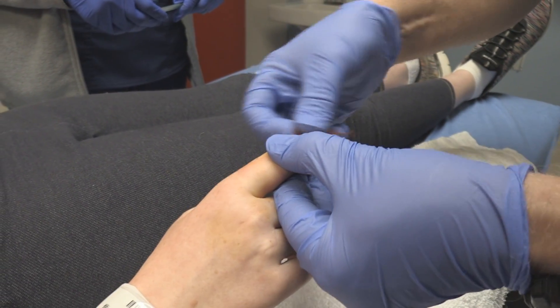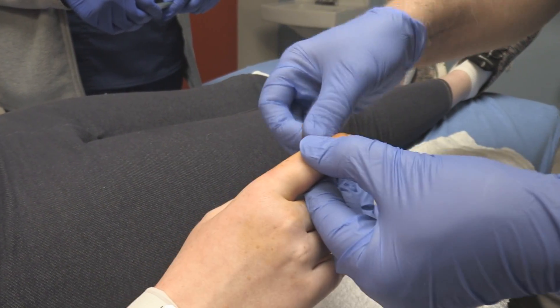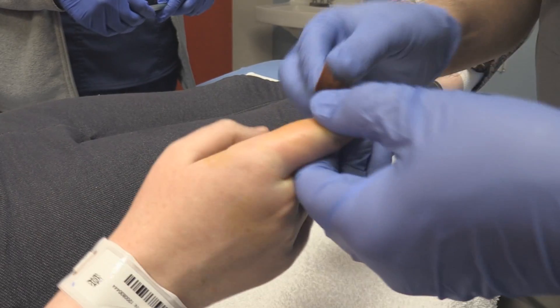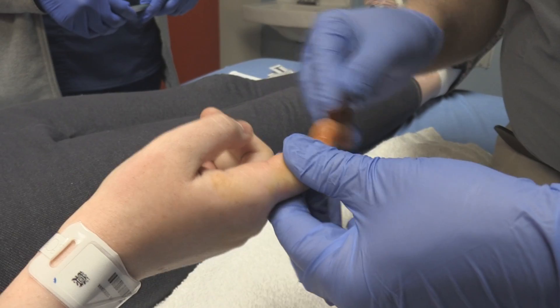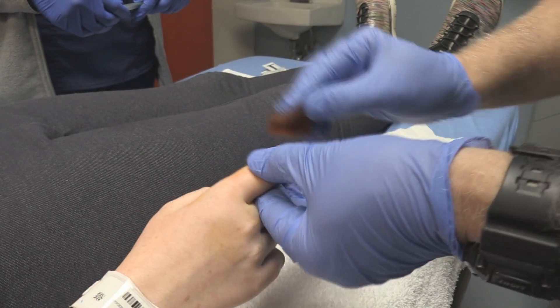So what we're going to do for starters, we're going to do some betadine topically. She's had a digital block that has been completely successful. This really was more of a metacarpal combination digital block that we did.